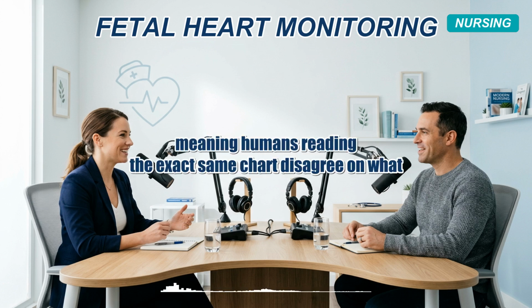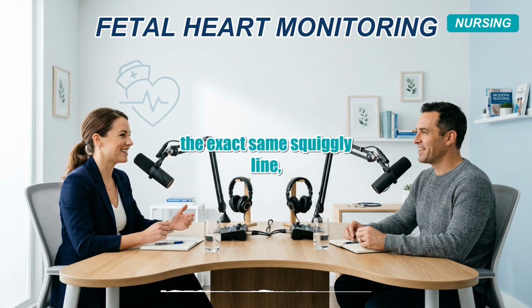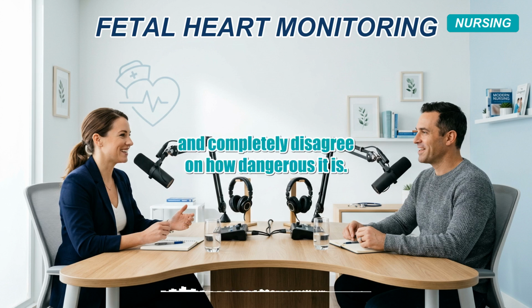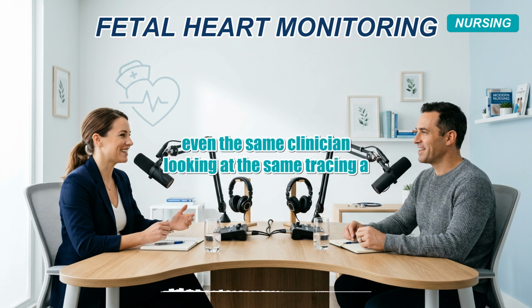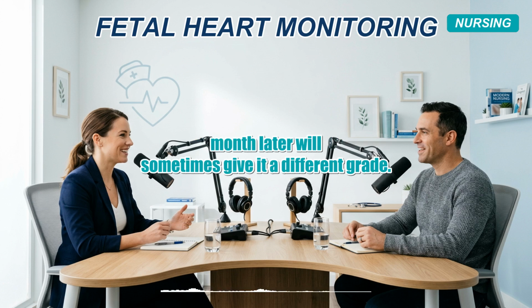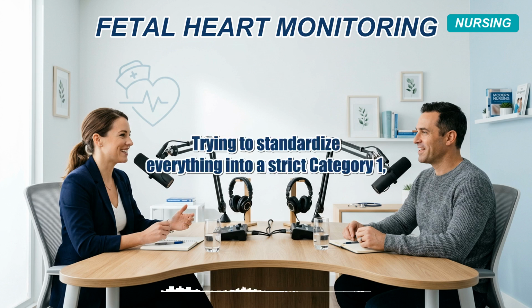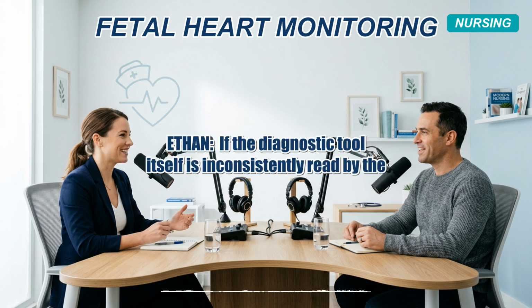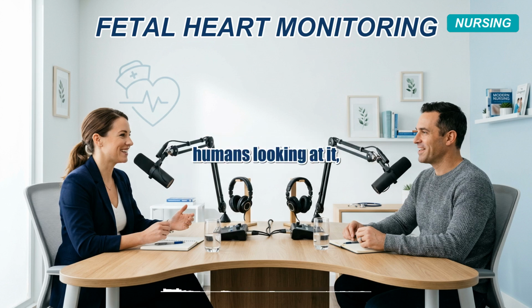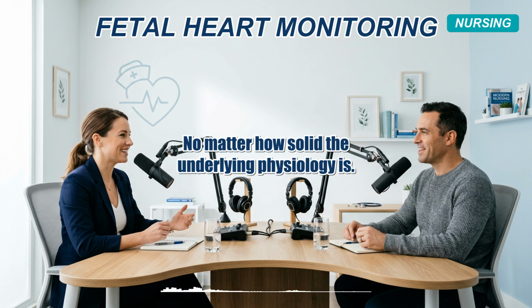Inter-observer reliability, meaning humans reading the exact same chart disagree on what it says. Radically disagree. Different clinicians will look at the exact same strip of paper, the exact same squiggly line, and completely disagree on how dangerous it is. In retrospective studies, even the same clinician looking at the same tracing a month later will sometimes give it a different grade. And this is true even with the National Institute of Child Health and Human Development trying to standardize everything into a strict Category 1, 2, and 3 system. It doesn't matter. If the diagnostic tool itself is inconsistently read by the humans looking at it, its clinical value is inherently constrained, no matter how solid the underlying physiology is.